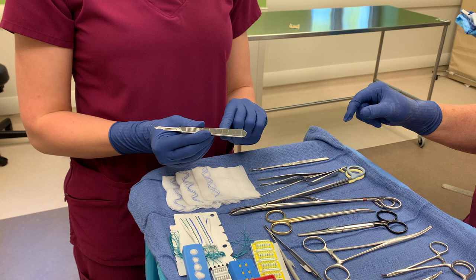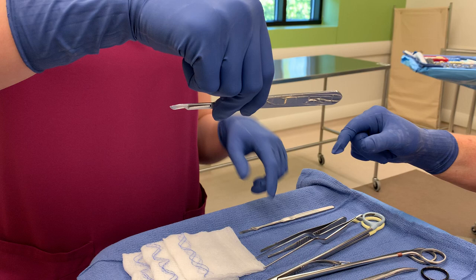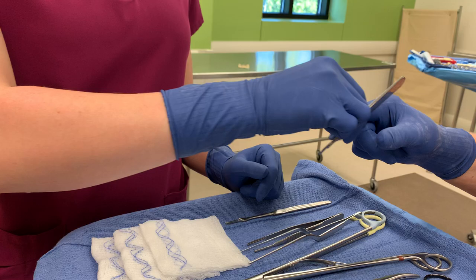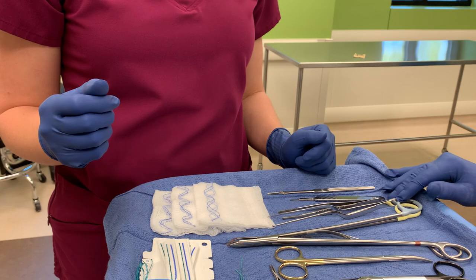For the blade, we have a 15 blade loaded on a number three knife handle. I have it pointed away from my surgeon and my team, and I pick it up from behind the blade. I'm not holding the blade, but I'm not holding too much on the knife handle so that the surgeon can grab it. They take it just like a pencil, and I am up and away — that's how the surgeon will take the blade.